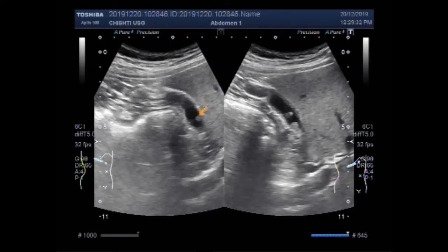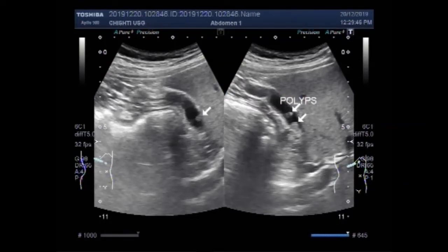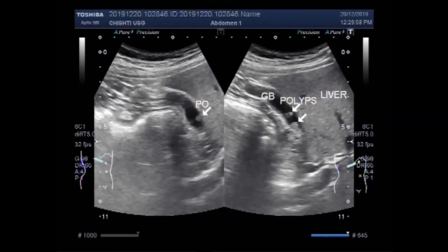You can see the gallbladder along the anterior wall, and these are the two polyps seen along the posterior wall of the gallbladder. The position of the polyps remains the same even by altering the posture of the patient.